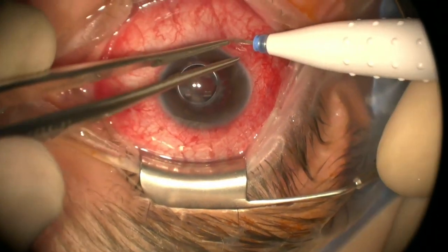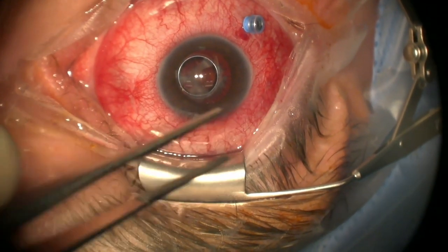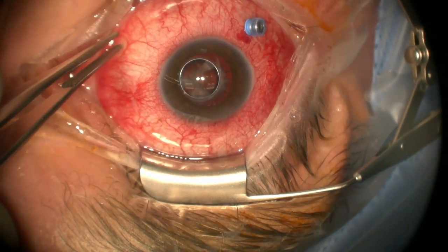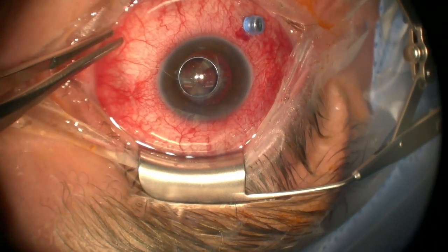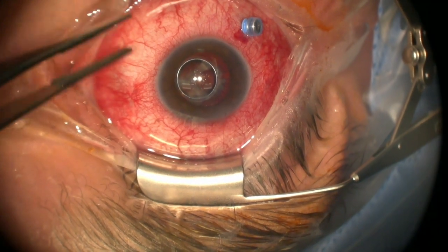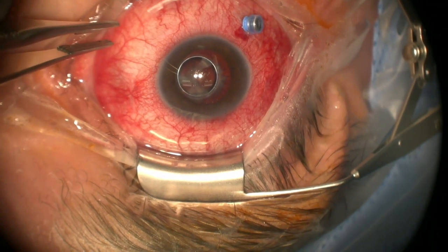And I know I didn't measure here. That's about 3 millimeters. How you doing, Eric? Okay. That hurt? We're going to make you a little more numb. And so how we're going to do that, Eric, is we're going to pull up some more block and some scissors here.